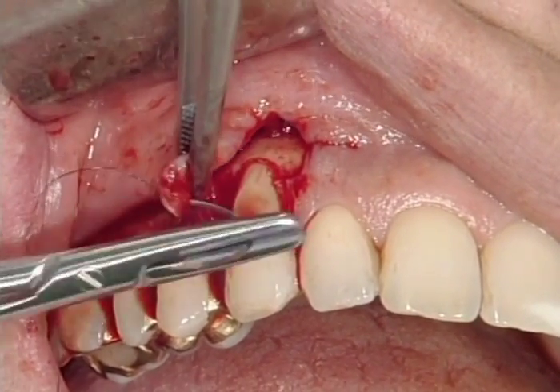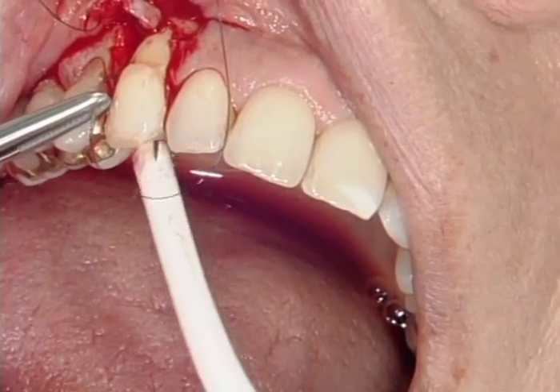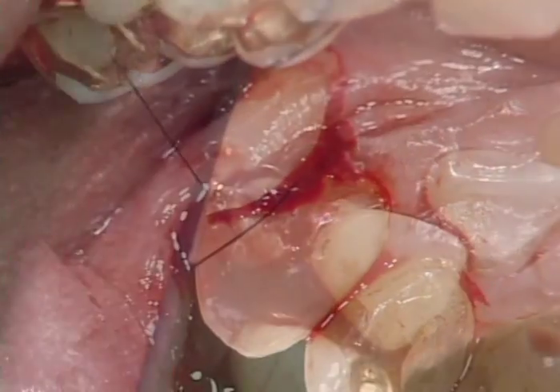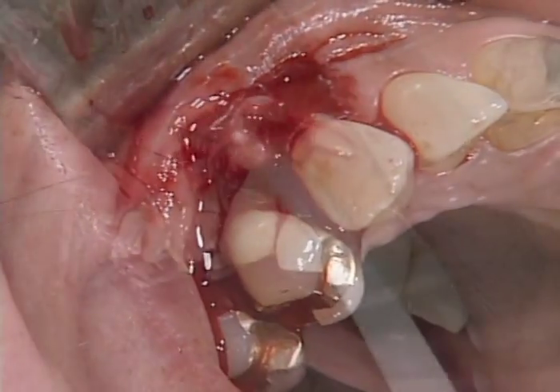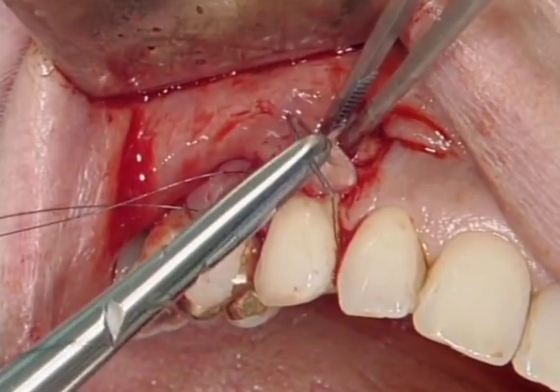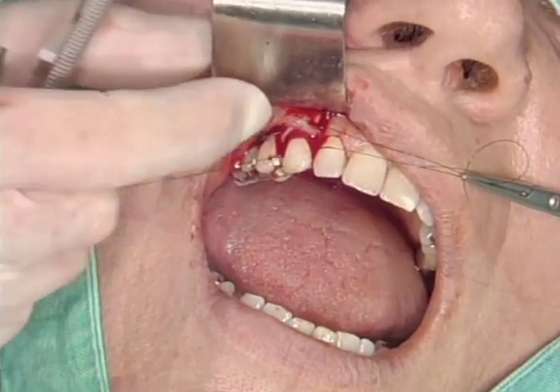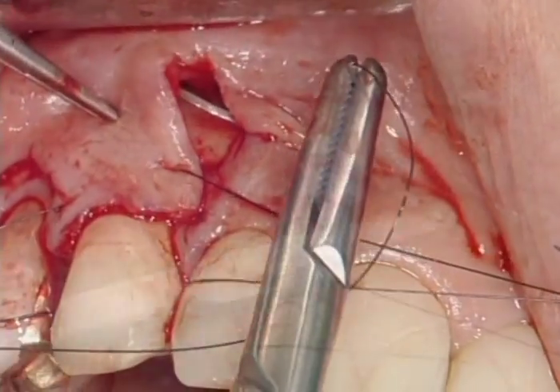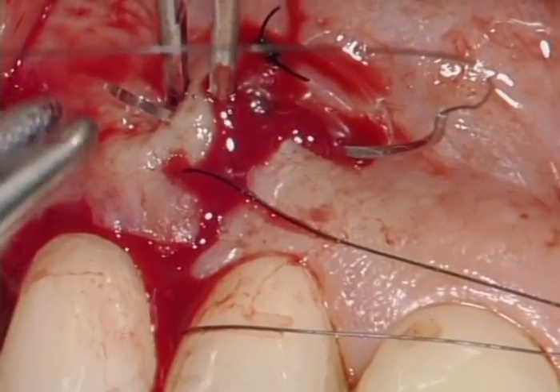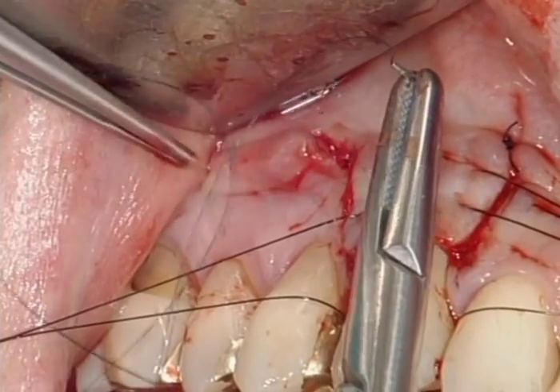Pre-suturing is carried out at the coronal end of the flap using 5-O Vicryl or Supramide suture material. The second pre-suture is adapted to allow a tension-free final flap and wound closure. Little mosquito clamps are used to retain the thread ends and to keep the different sutures apart. The vertical releasing incisions are sutured in a tension-free manner, and the mobility of the flap must allow access to the root surface for the application of EMDO gain. The flap must also be able to re-cover the root surface entirely.